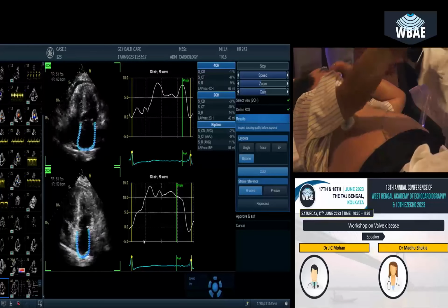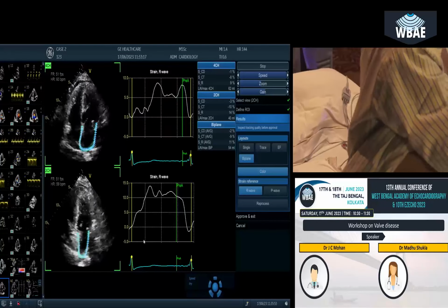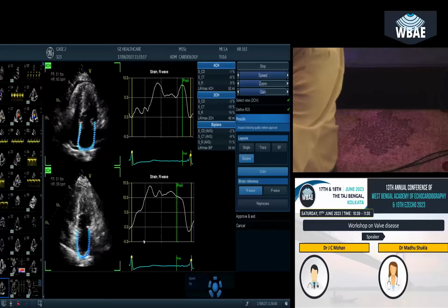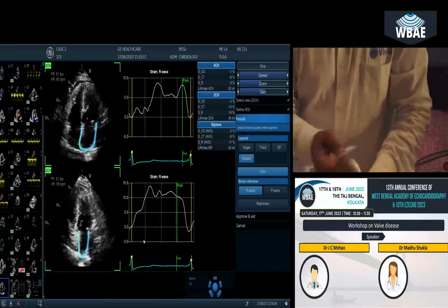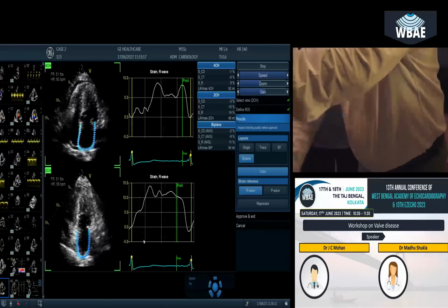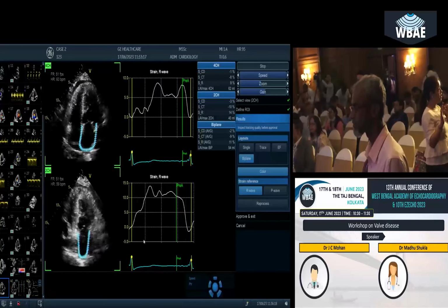Okay, sir, we'll do the quantification. And sir, also one thing, once you're taking the diastolic size in LV, how do you delineate the papillary muscle from the LV cavity? Because you might also be measuring the papillary muscle, since it's so thickened, so you can make a mistake there. In short axis, in the distal cavity you can get confused. In mid cavity you will not make a confusion. See, the measurement is in diastole. Wall thickness measurement is in diastole. There is no confusion with the papillary muscle at that time.